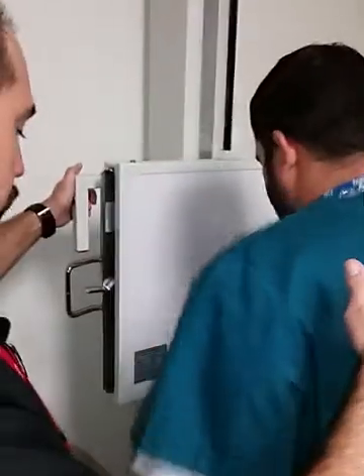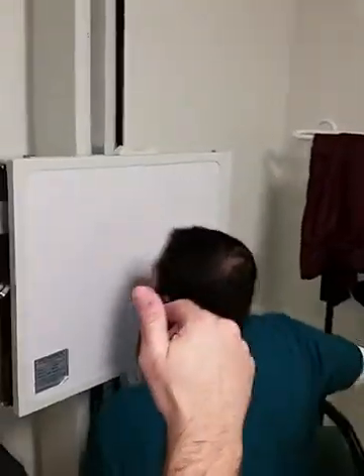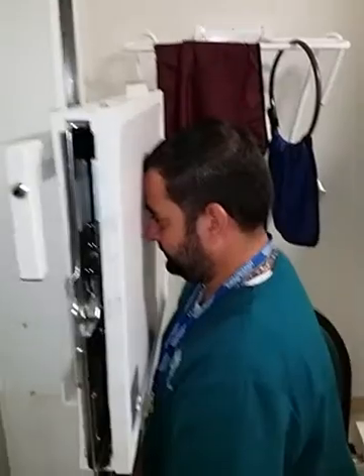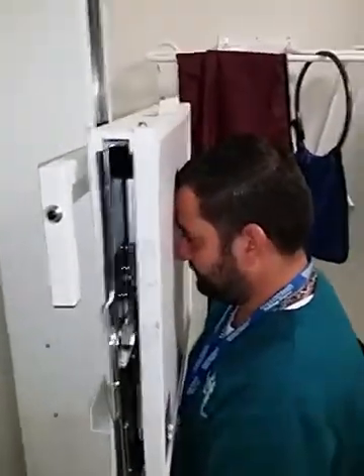Yes, it's the Caldwell view. So you're going to start out facing toward the board, and you're going to place your nose and forehead against the board. All right, so this is the basic start point here for our Caldwell. We're going to angle 15 degrees.